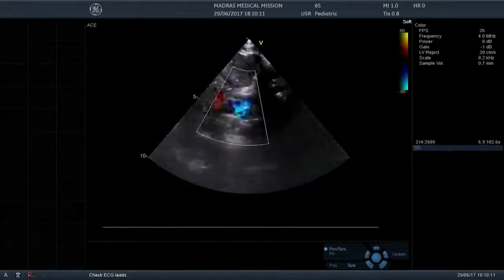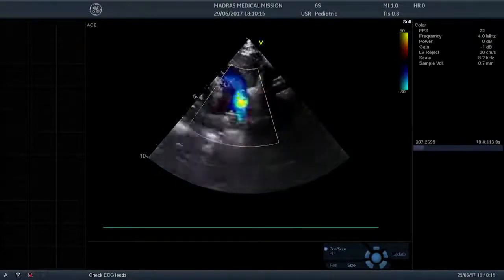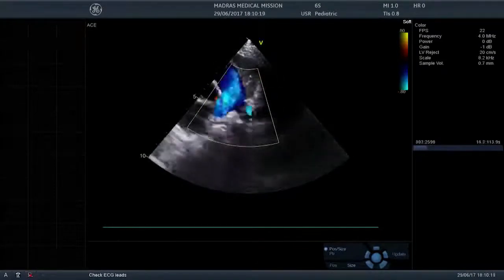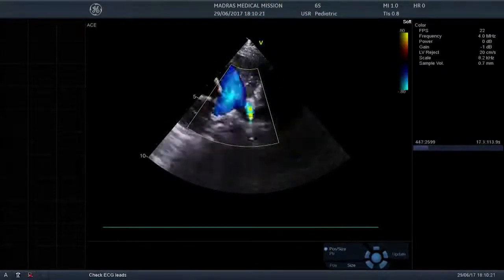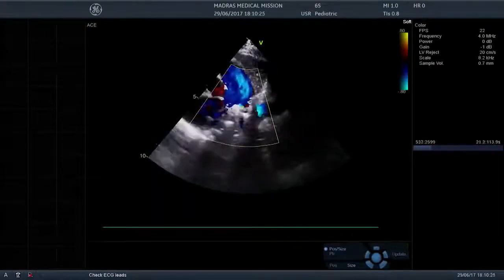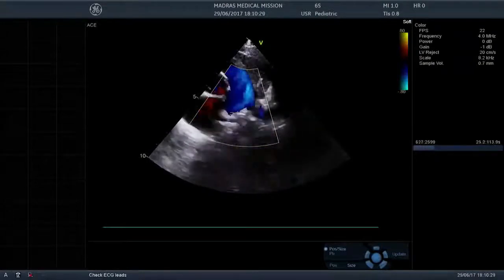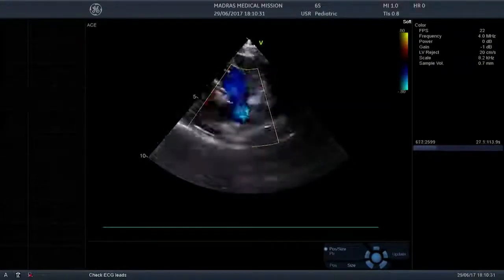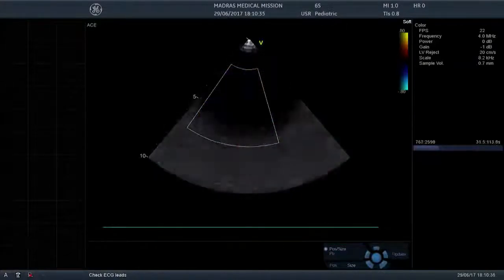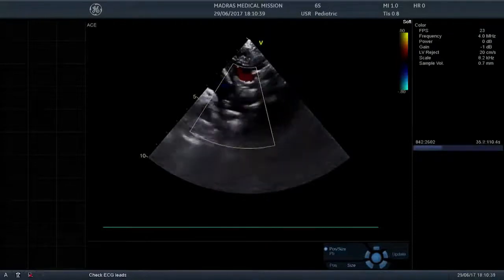Okay, so show the branch pulmonary arteries, short axis. It looks like the ductus is reasonably closed off. Yeah, there's no leak. And just show us the aortic arch view as well. Suprasternal. Giri, put his hand under the shoulder. The child is on just sedation with a small dose of ketamine, is spontaneously breathing.